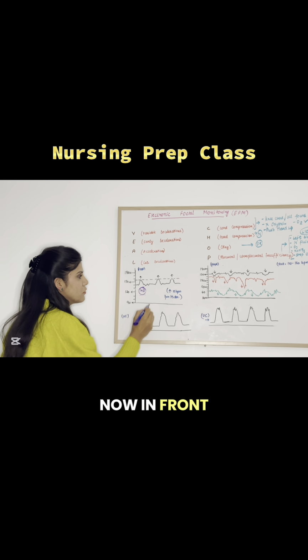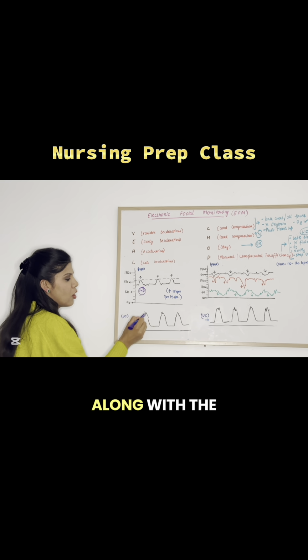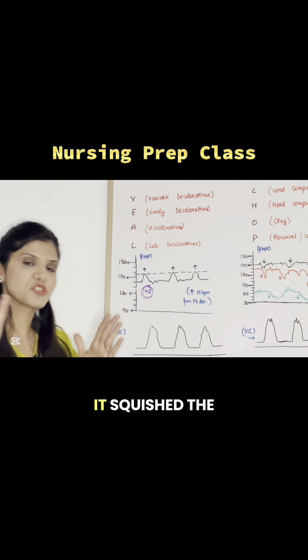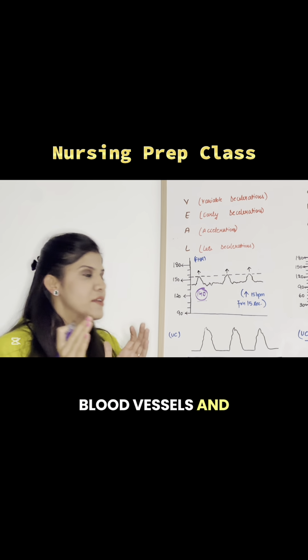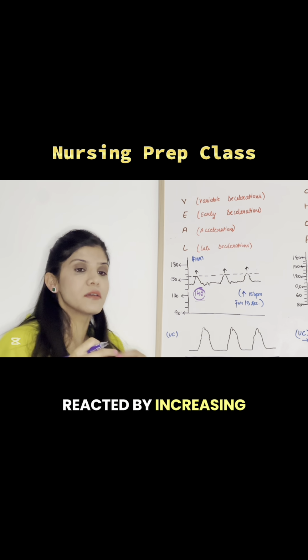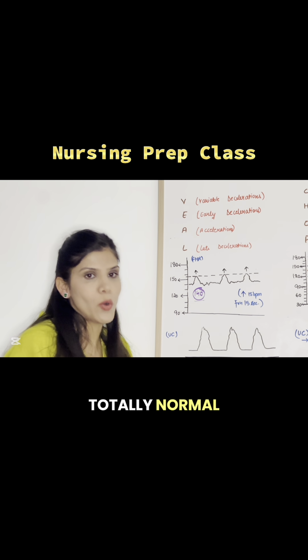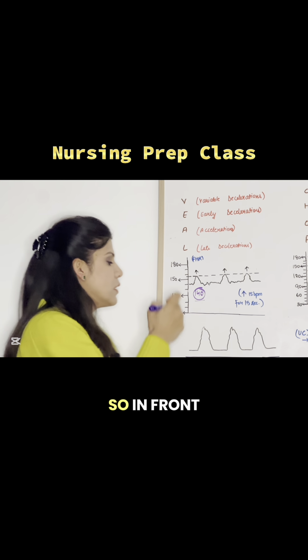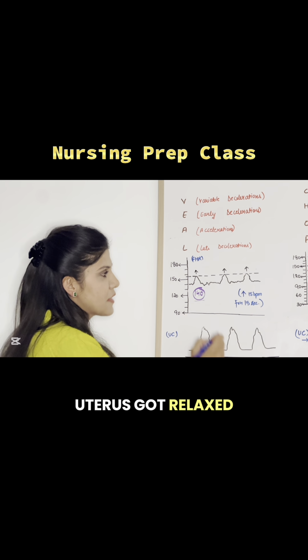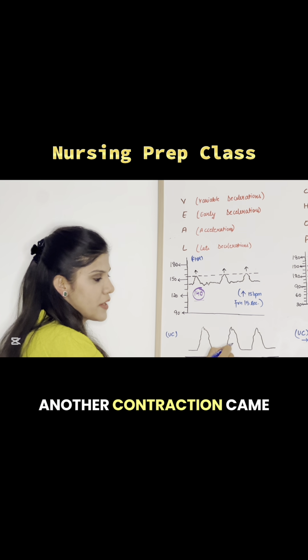Now, in front of the uterine contractions, take a look how the heart rate was increasing along with the uterine contractions. So the uterus contracted, it squished the blood vessels, and it squished the baby's head, to which the baby reacted by increasing the heart rate. This is what we call acceleration, and this is totally normal. This is fine. So in front of the uterine contraction, we have acceleration, the uterus got relaxed, the heart rate returned back to the baseline.